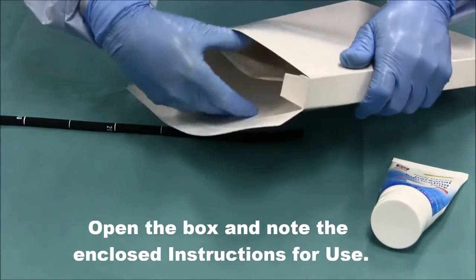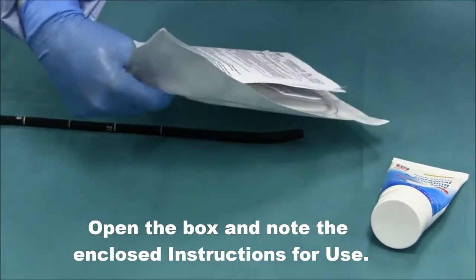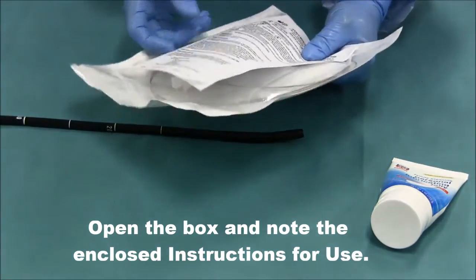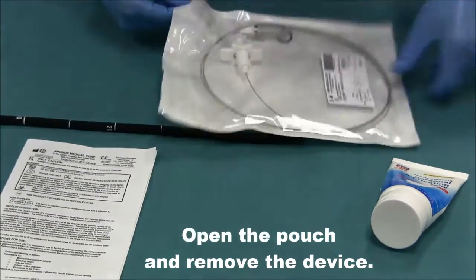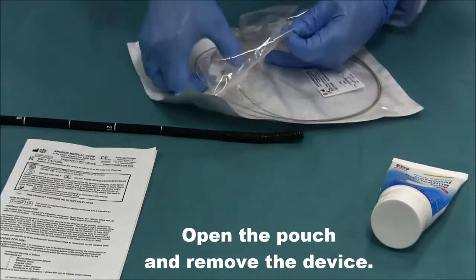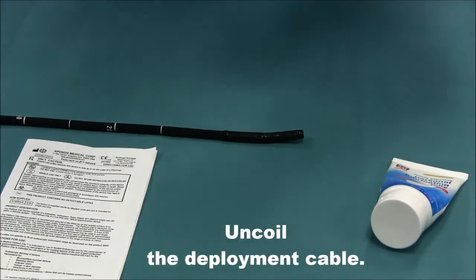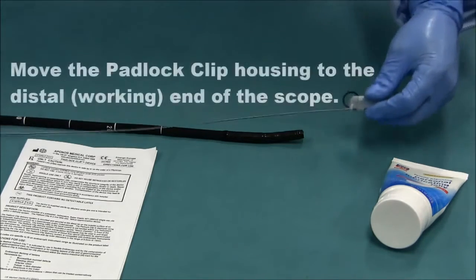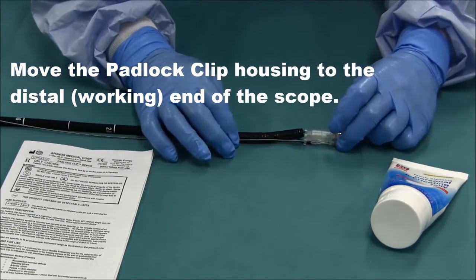Open the box and note the enclosed instructions for use. Open the pouch and remove the device. Uncoil the deployment cable. Move the padlock clip housing to the distal working end of the scope.